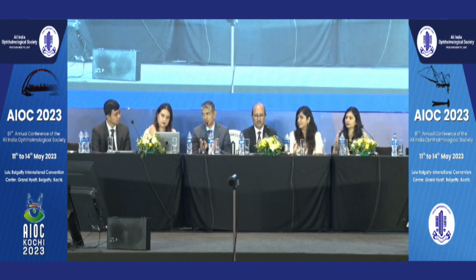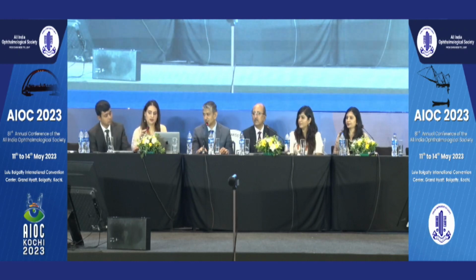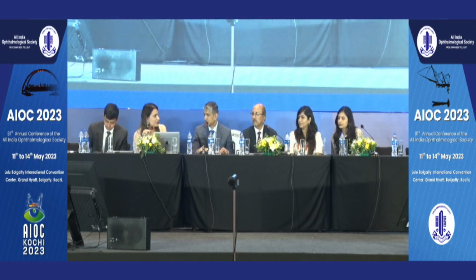He also says that because of the pressure against the equator, the lens epithelial cells are kind of held there, and the incidence of PCO is very low. But again, this is something new that is being introduced. So there are various solutions. You will have to be aware of the solutions, look at what is best for your patients, and then do that. What is your take on using a CTR with toric IOLs?